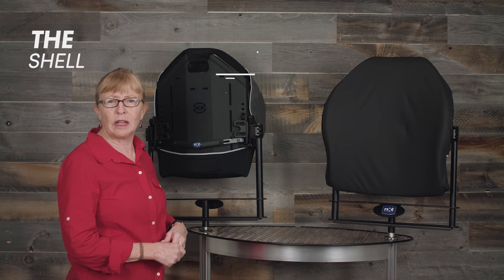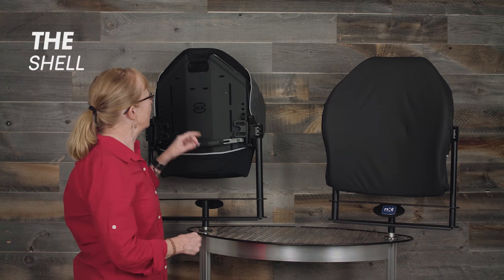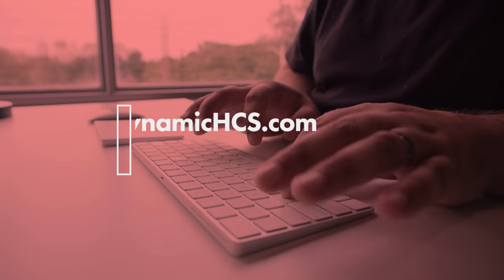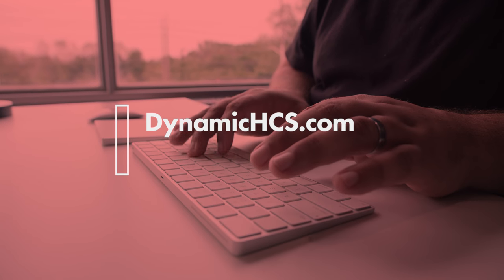The back supports are made out of a very lightweight aluminum shell with extra ribs built in for strength. For more information, please visit our website at dynamichcs.com.